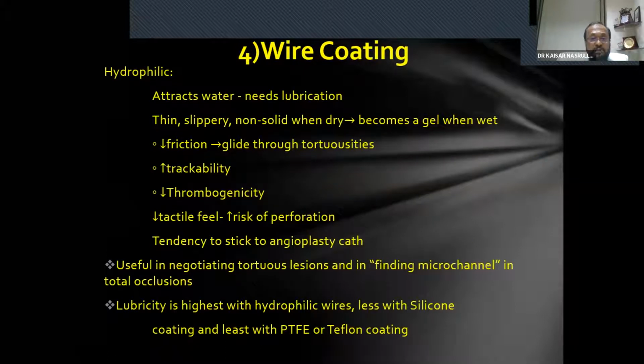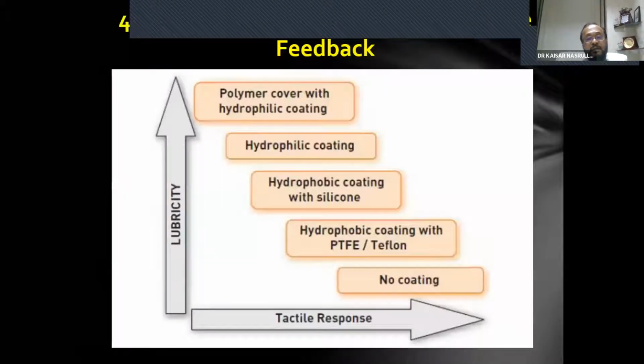So usually hydrophilic coatings are thin, slippery, and become a gel when wet. On the contrary, hydrophobic coatings are not slippery. They give good tactile feeling. When the wire becomes more hydrophilic, it becomes slippery or lubricious. And when it becomes more hydrophobic or has no coating, it gives good tactile feeling.